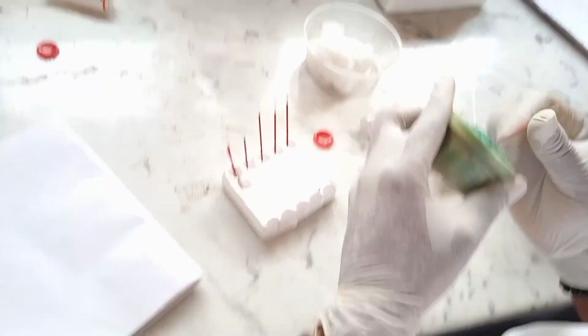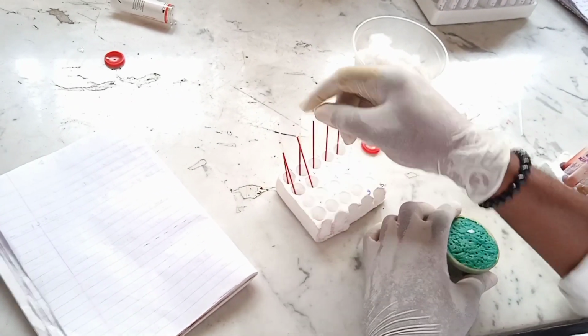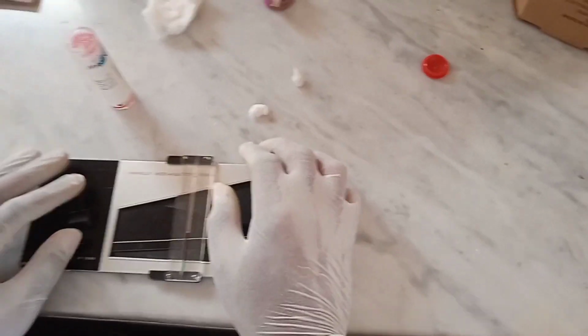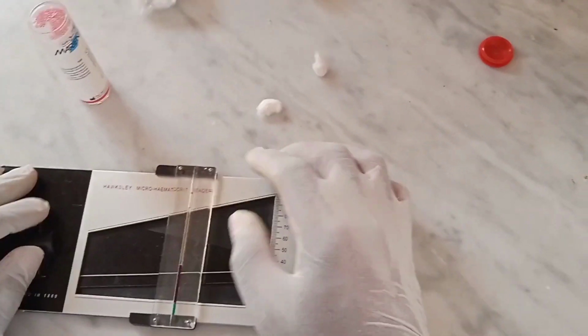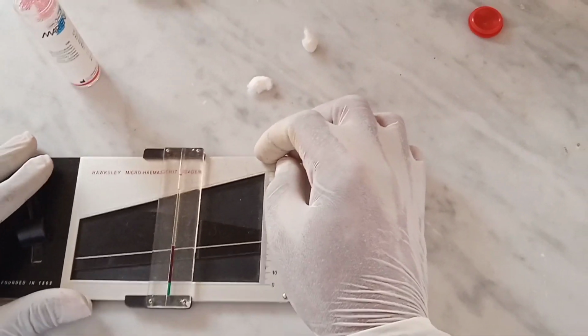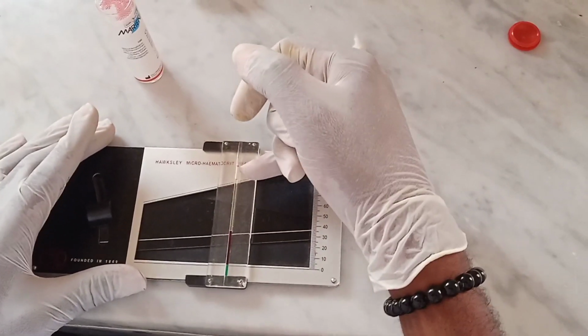So this is basically how the PCV, that is the packed cell volume test, is done. This is one of the procedures involved in doing it, and this is also down to the final point where you actually take the reading of the packed cell. As you can see there, there is the red part and there is also the transparent part.